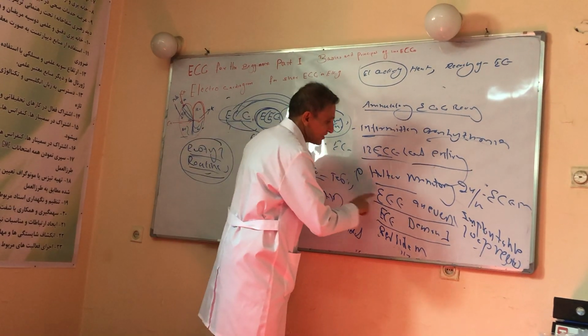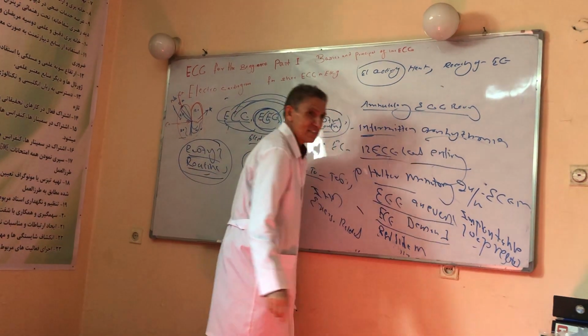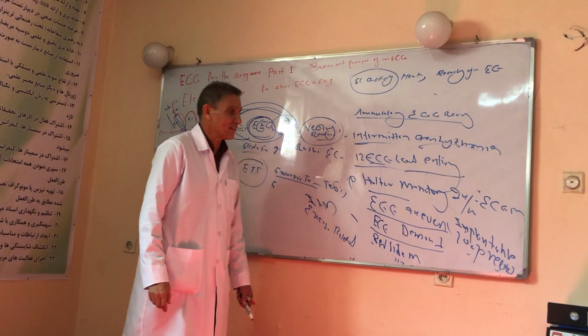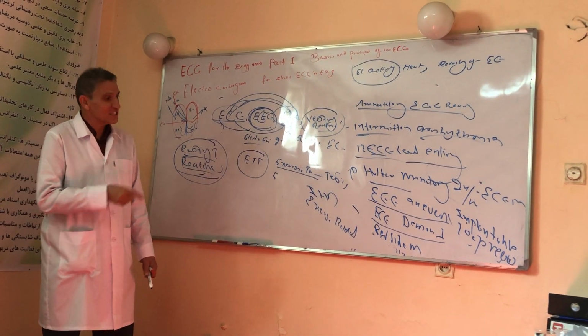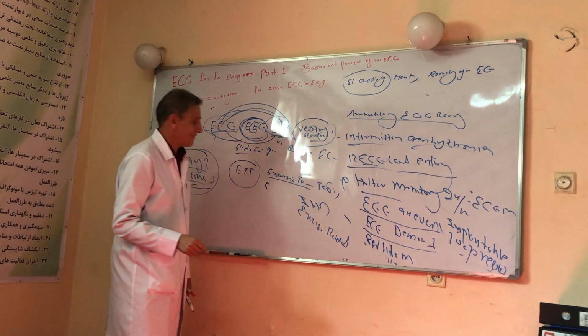Number two, ECG on demand. Number three, ECG on event. Number four, ECG bedside. And finally, implantable loop recording. This also needs a detailed discussion. Inshallah, we'll discuss each of them in our next or future lecture.